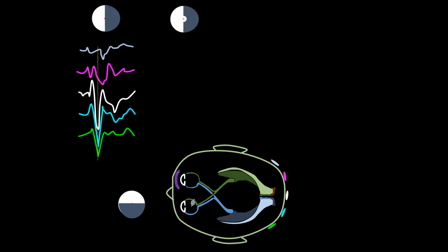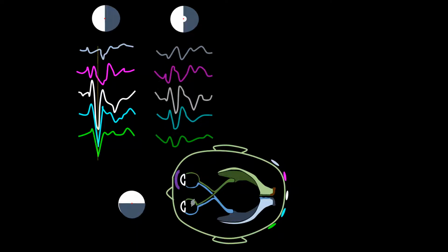Now a new field is introduced in the same fashion, except that the foveal area is blocked. You can tell because I made it white, thus creating an artificial central scotoma. Such stimulus will produce a set of waves with different characteristics.